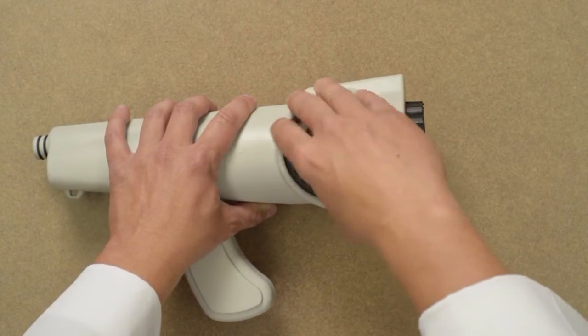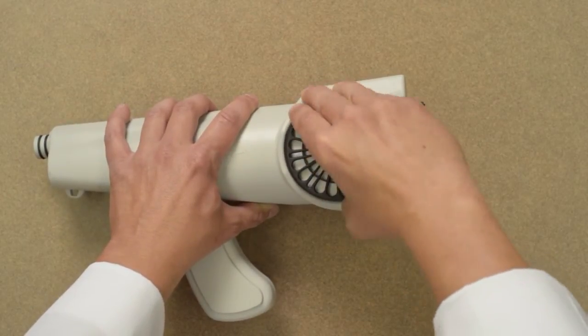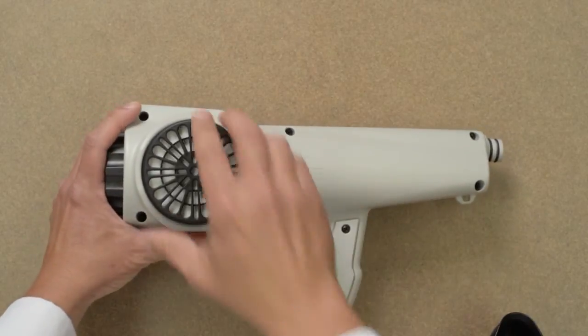Instead, back it out and try to install it again. Continue to turn the cartridge until it seats completely into position. Give it a firm one-sixteenth to one-eighth additional turn. Then turn the Nasal Ranger over and repeat the procedure for the other cartridge.